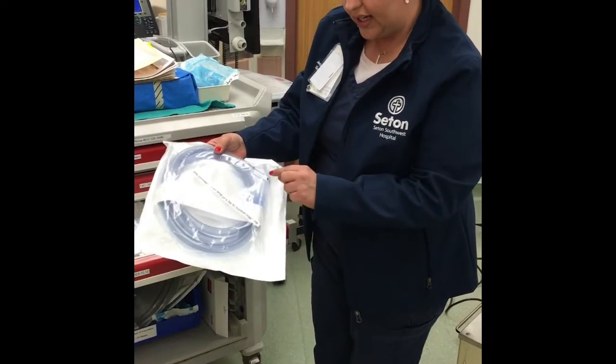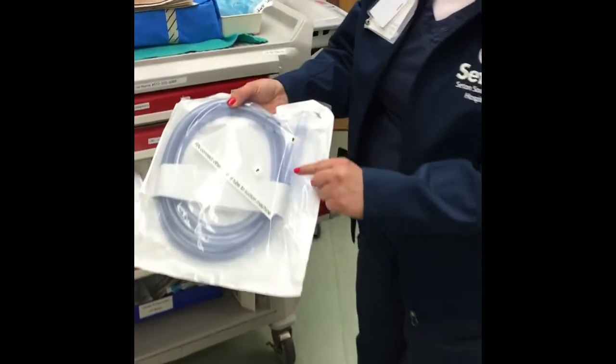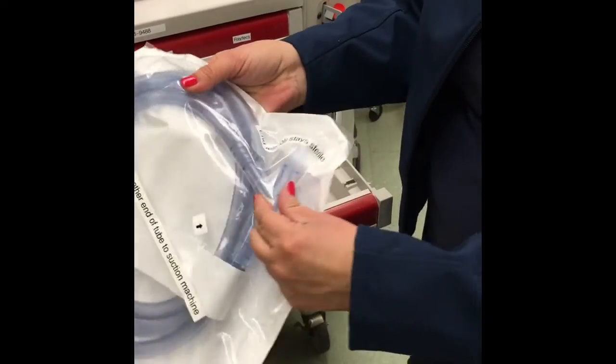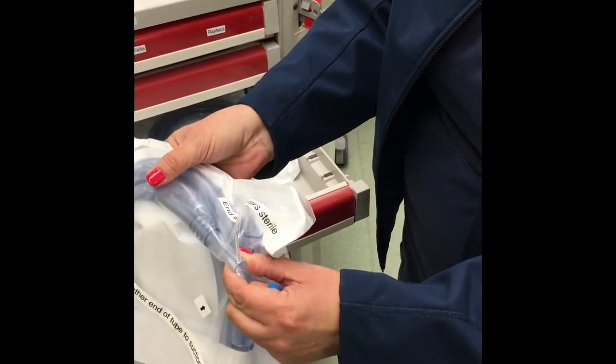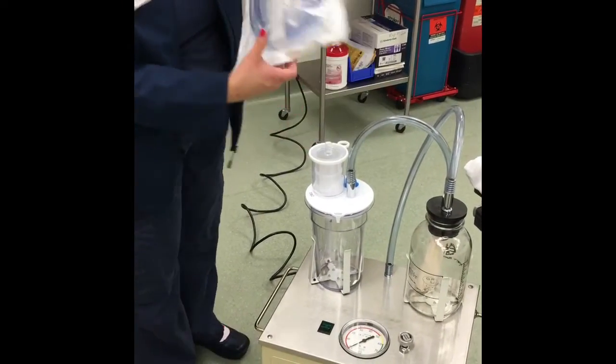If you look at this, it tells you which side goes to where. There's a little hole where there's an adjustment for suction that goes to the sterile field, and the other part that connects into the machine is this section. So they're gonna pass that off to you while it's sterile, and it's gonna connect into here.